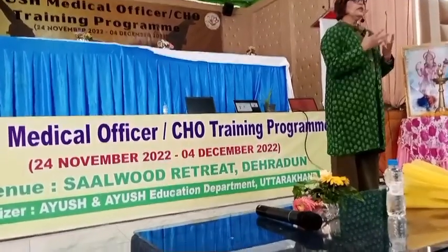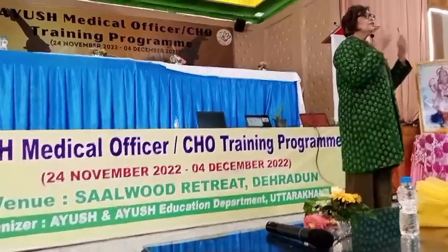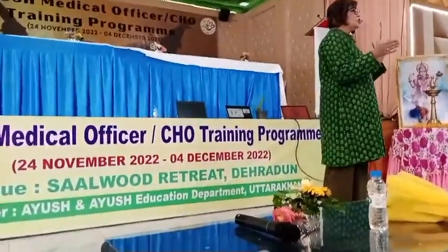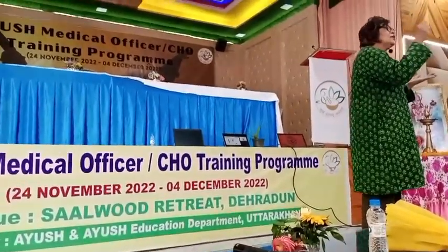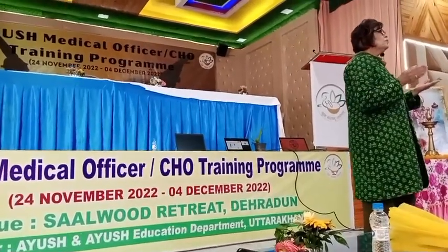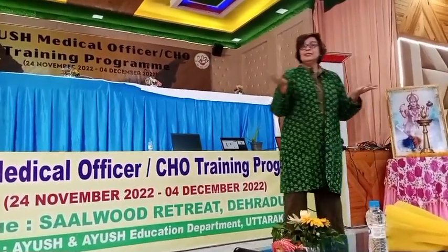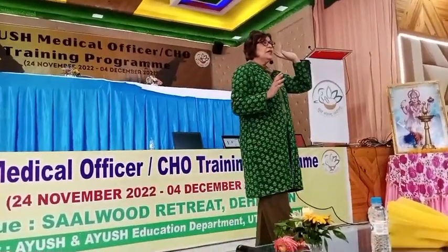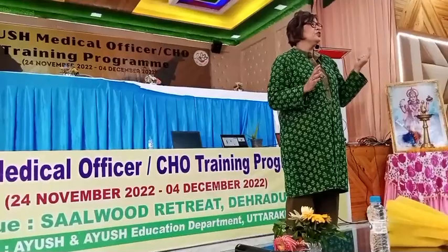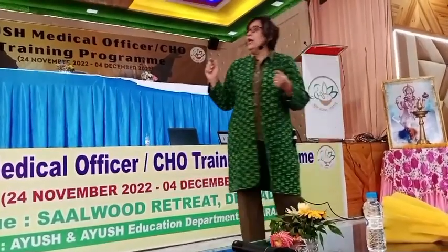If you have looked at hemoglobin, you also see what kind of anemia the patient has. Nowadays the instruments in our hematology have all the indices, and you have to read the graph, read those indices, and from there you can tell whether it is iron deficiency anemia, megaloblastic anemia, or thalassemia, because those indices tell you everything now. So before you make a slide, before you do iron studies, you will be able to see that. That is the advantage of technology today. So when we take the whole blood in EDTA, don't touch, inverted, you get hemoglobin, whether you have infection or not, TLC, DLC, everything comes out with that. Platelets.